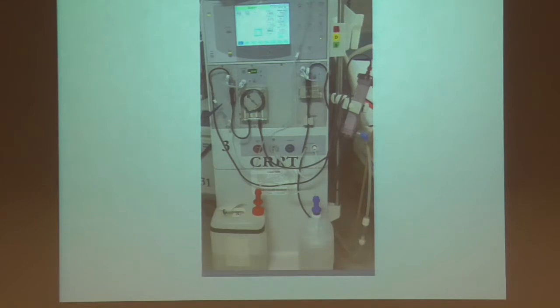So one more thing I want to touch on is that dialysis before the addition of this blood roller pump right here was actually incredibly scary and difficult. I remember my mentor last year was talking about when he finished fellowship way back, they would use the patient's blood pressure as the actual blood flow rate. So they could not ever control how much blood flow ran into the machine. So that's why you heard of all these gruesome disasters. At that time, they would also use CAVH.